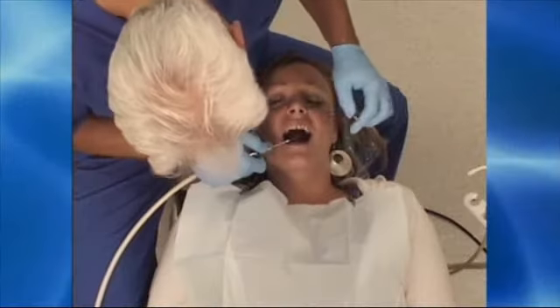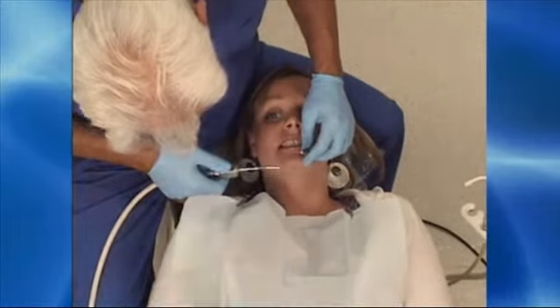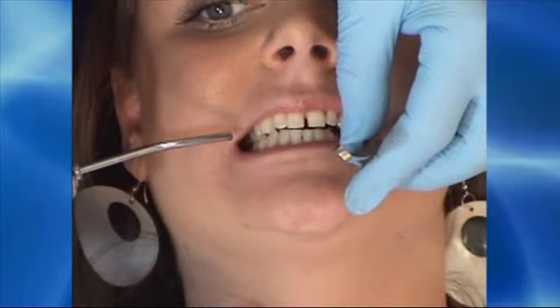So here I'll air dry the teeth again and place the paper on the patient's left side and have them repeatedly move to the right as I try to locate the contacts on the upper and lower left that are prolonging the disclusion.